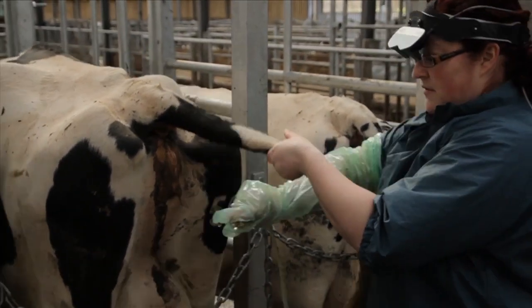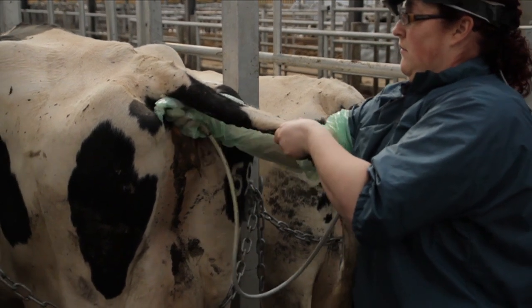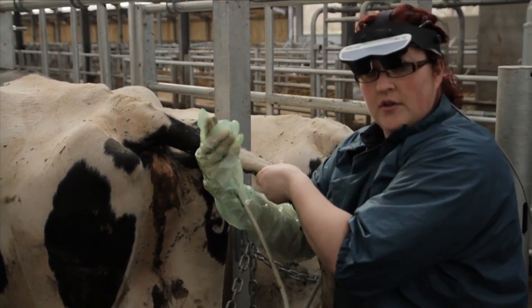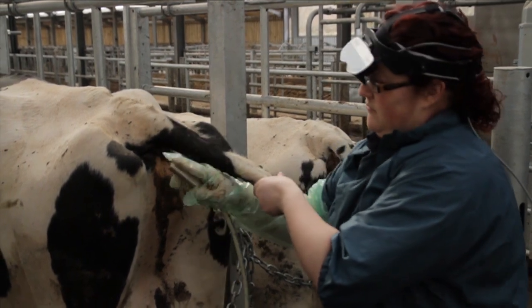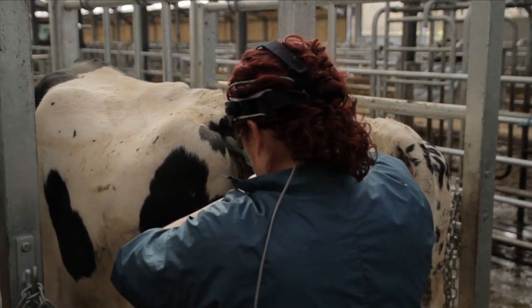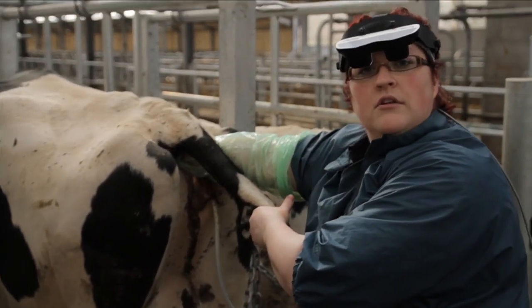Up to our next cow, use the back of our hand. Grasp the probe with the leading edge, hold it in the palm of our hand, use our thumb as a backstop, and go into the cow.